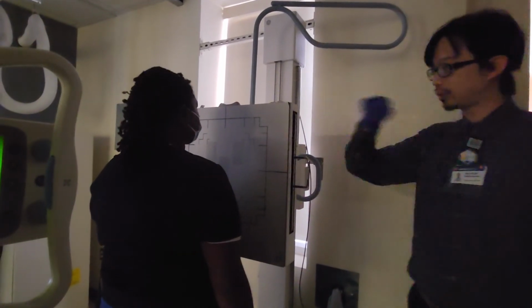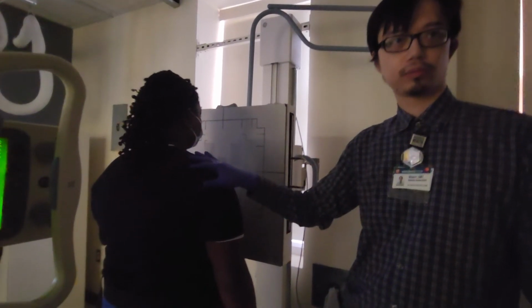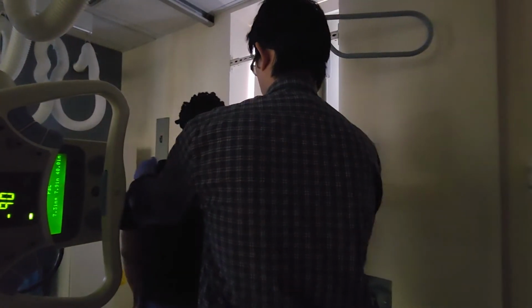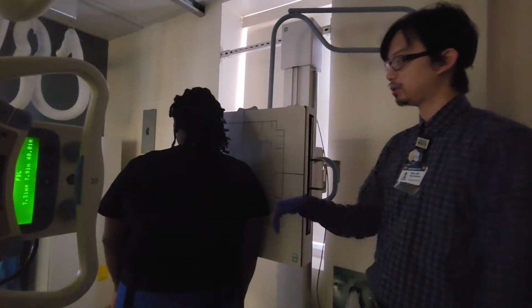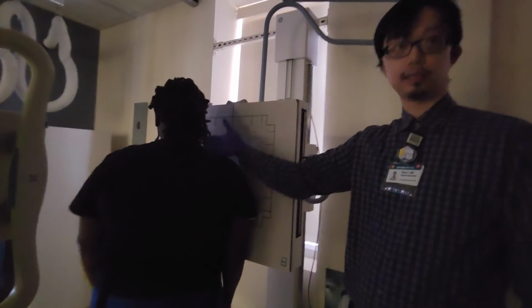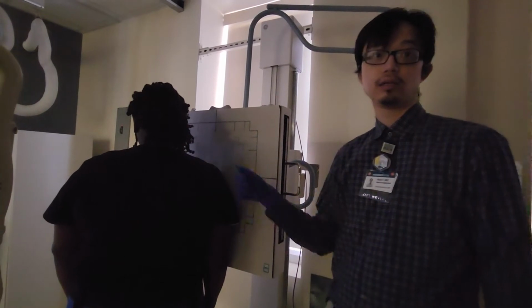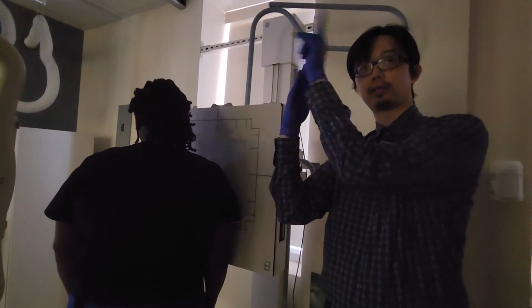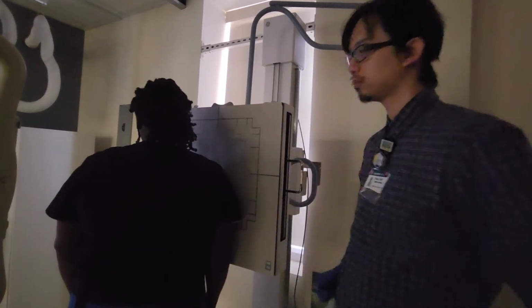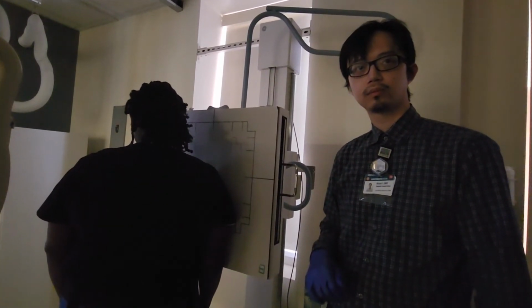So for the purposes of demonstration, I am going to do this for the right shoulder, so it's easier for us to see. So Shamika, if you would turn to put your right shoulder up against the board, nice and close. Good. So the idea here is that right now the scapula looks like this, right? The body of the scapula is basically perpendicular to the IR. So that is how we're going to form that stem, the bottom part of our Y. And over here you've got the acromion and the coracoid sticking out. So that is the scapula, the long part of the Y.